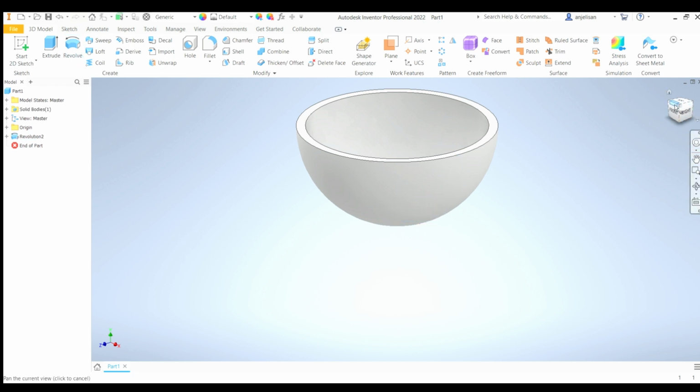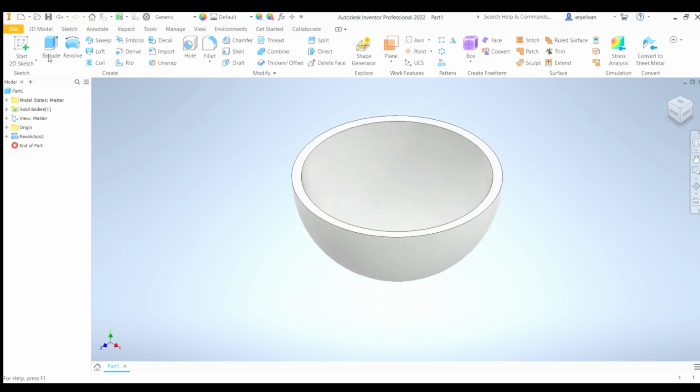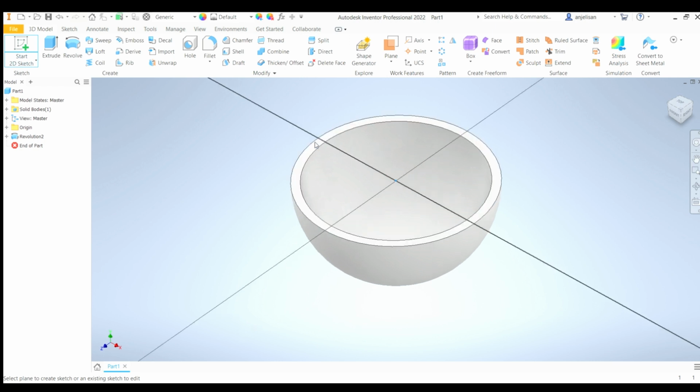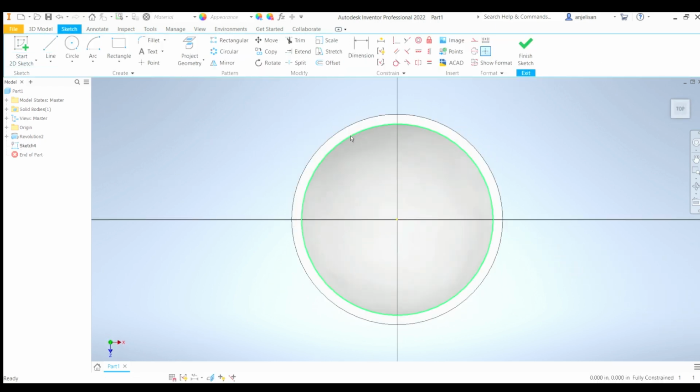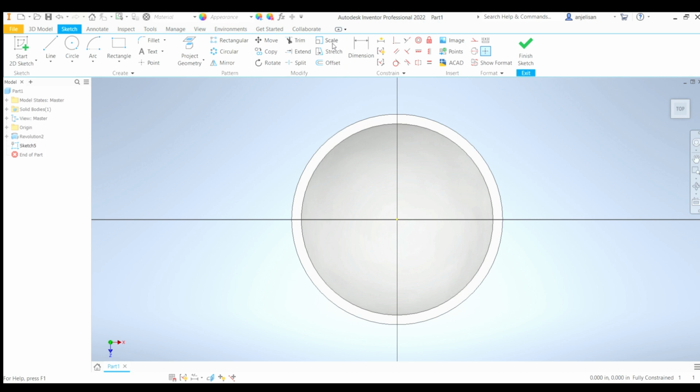So now we have our cup. Now this cup isn't going to be enough to hold on to the person's leg, right? This is just like a little bottle cap thing. So it's not enough. Let's add some height to it. So you can start your 2D sketch on top of this cup, and then select the face, this ring area here. You saw how it was green. Select this ring highlighted in green. So start your sketch there.